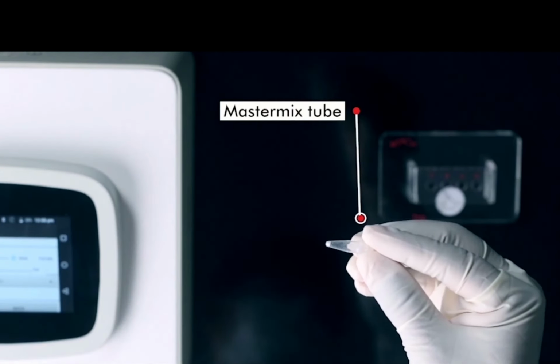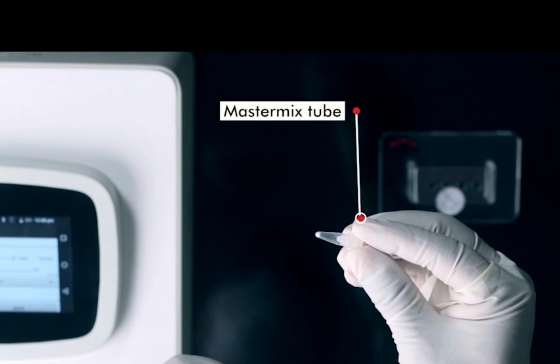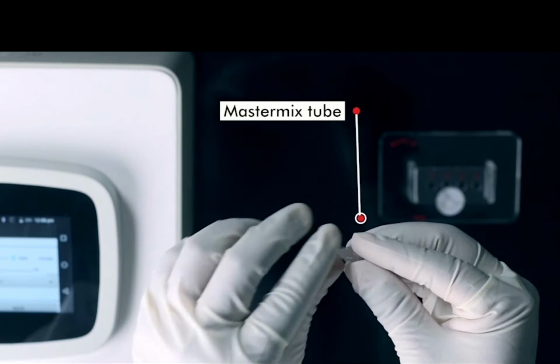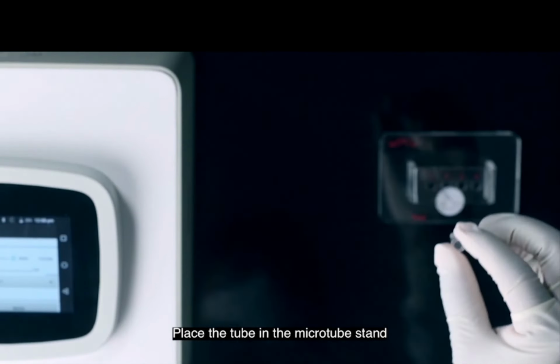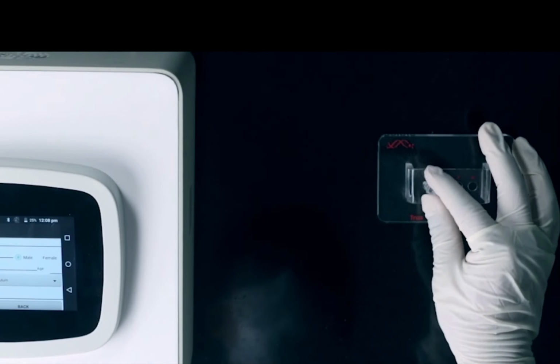Then we have this master mix tube. Here you can see that white color sphere is there down. Sometimes what will happen, that will be sticking onto the wall of the tube. That time you slightly flick it so that it drops down. So when you start the test, it has to be in the bottom position. That you must pay attention. Open the rubber cap and throw it and put the tube in the PCR tube stand.